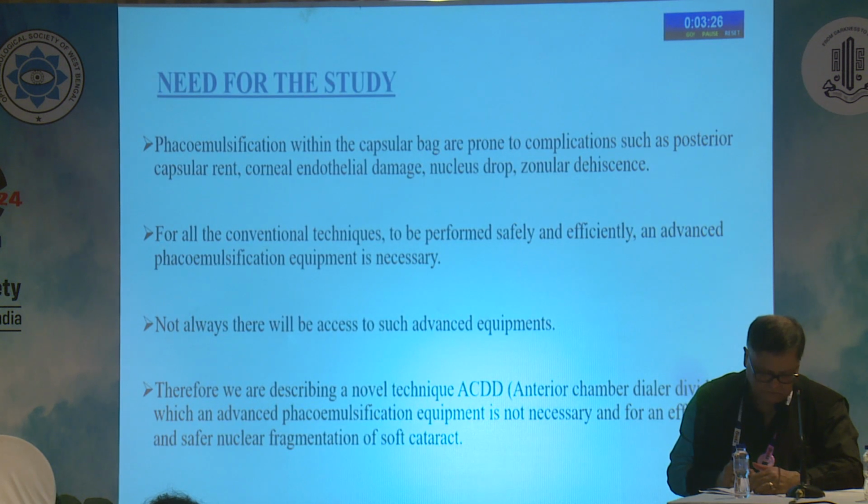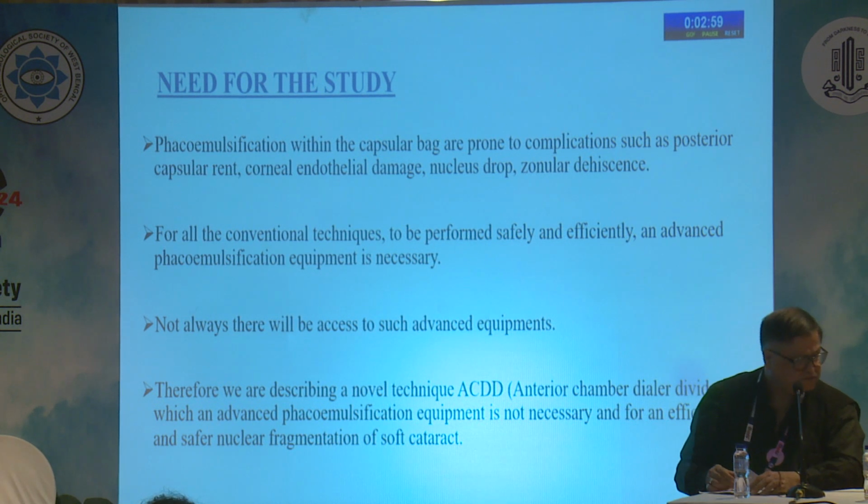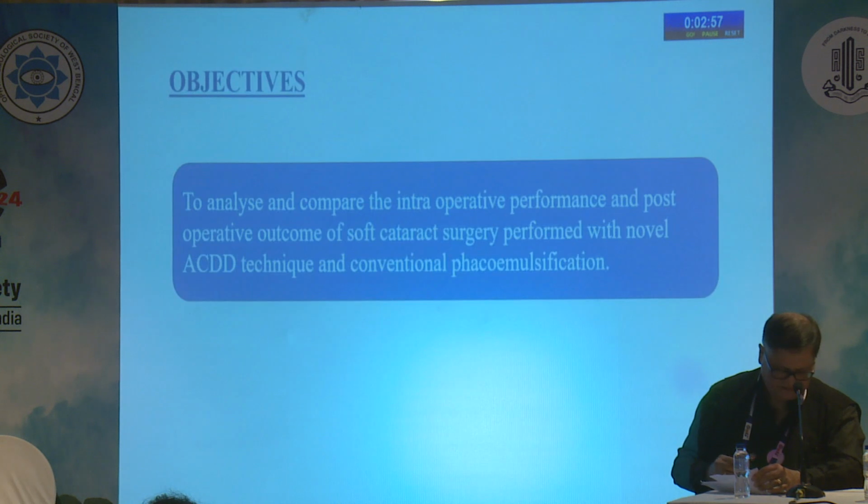Phaco within the capsular bag is prone to complications such as PCR, corneal endothelial damage, nucleus drop, and zonular dehiscence. For all these conventional techniques to be performed safely and efficiently, advanced phacoemulsification equipment is necessary. Not always will there be access to such advanced equipment. Therefore, we are describing a novel technique, anterior chamber dialer divide, for which advanced phacoemulsification equipment is not necessary, and also for an efficient and safer nuclear fragmentation of soft cataract.